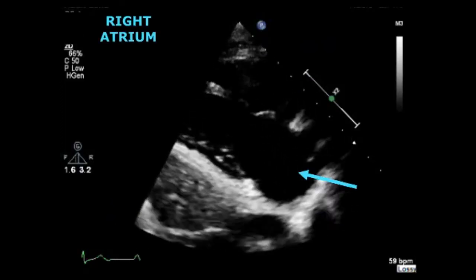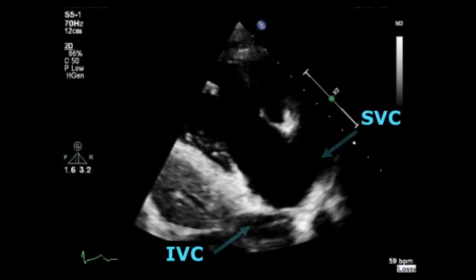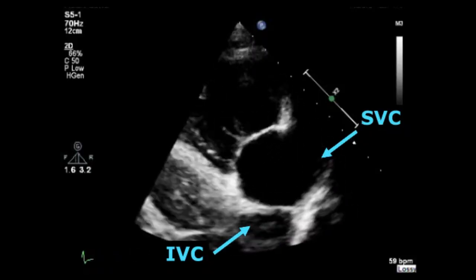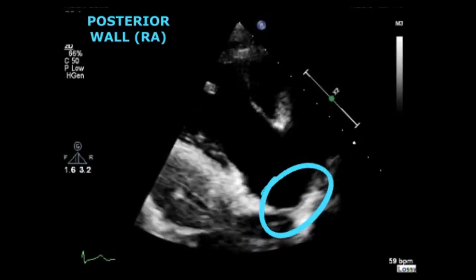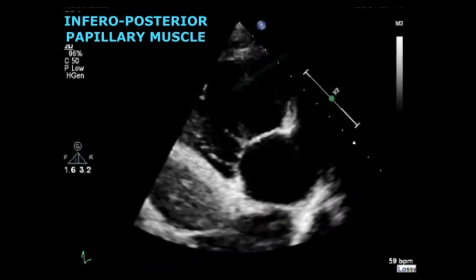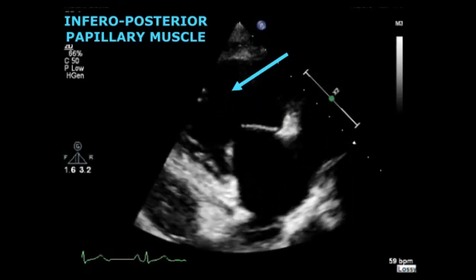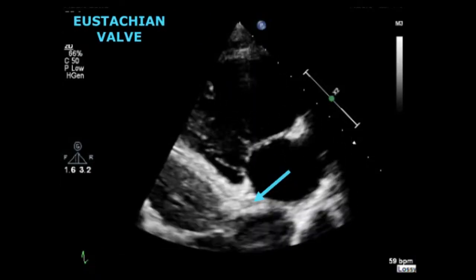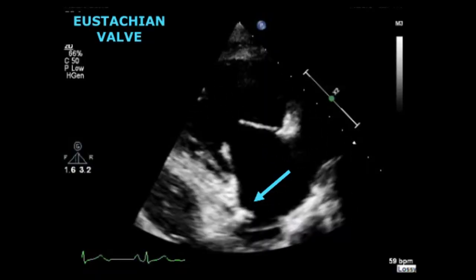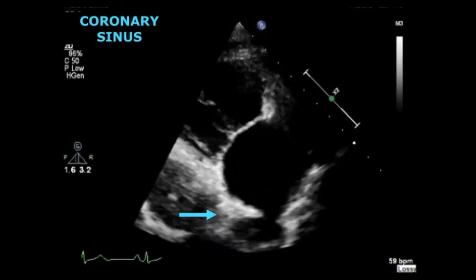The right atrium is at the bottom of the screen after the tricuspid valve. Entering the right atrium we can see the superior vena cava on the right hand side and the inferior vena cava on the left hand side. This bright thin line is the posterior wall of the right atrium. Attached to the tricuspid valve you can visualize the inferior posterior papillary muscle. Sometimes you will be able to see the eustachian valve, which is this thin blurry line, and also the coronary sinus, which is a tiny small black circle.